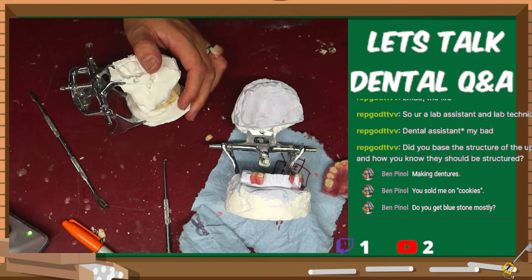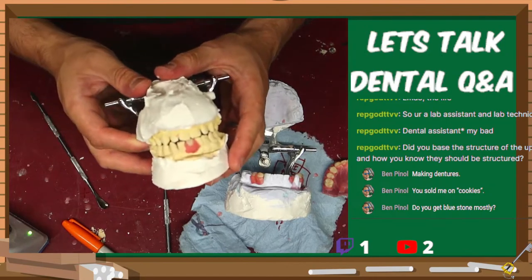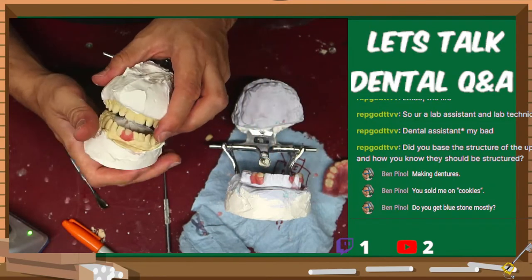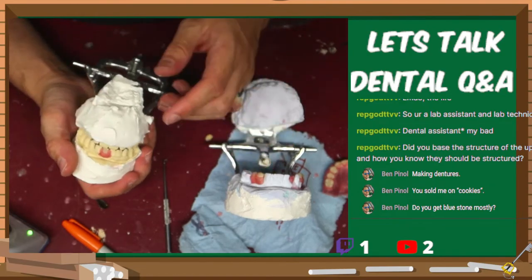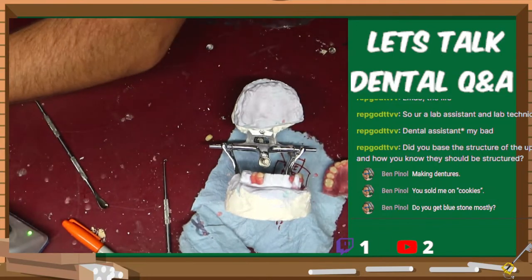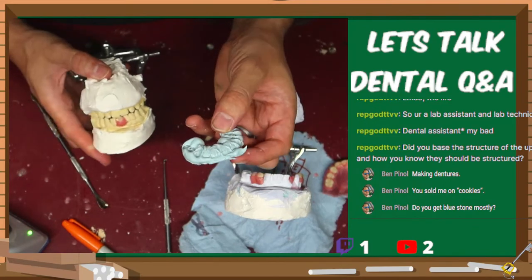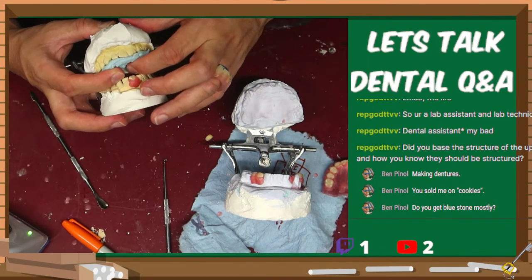Now, the big thing that's important when I get this articulator is whether it's biting down correctly. Unless it's a guess, I can for the most part guess the way that they bite together. But an important thing that I would always like to have is what's called a bite registration, something like this. It pretty much looks like a sheet of chewed-up gum. But I think this belongs to this person, if I remember right.